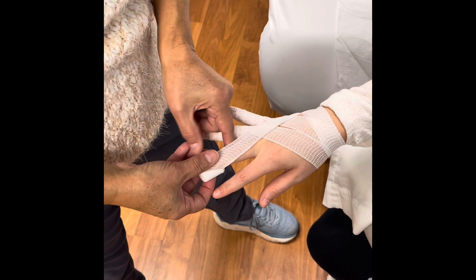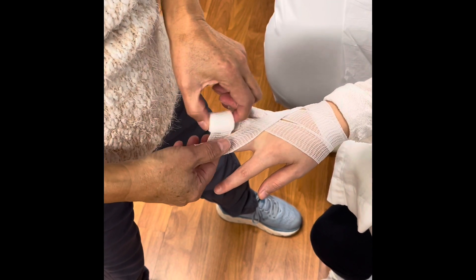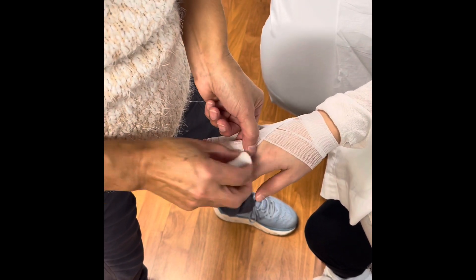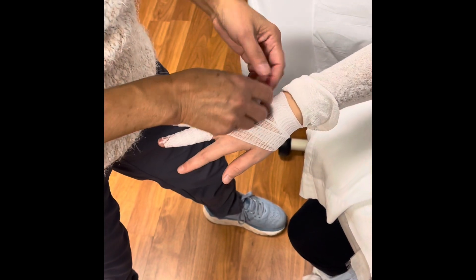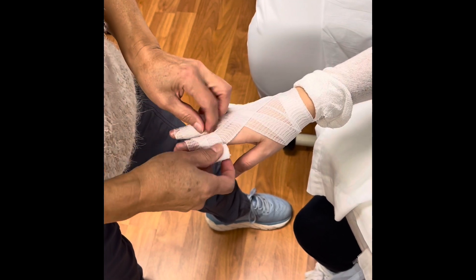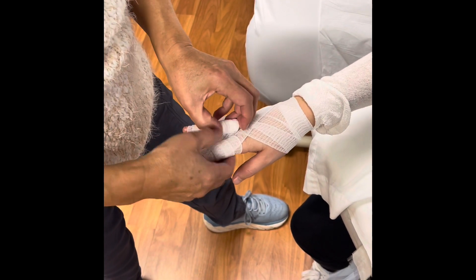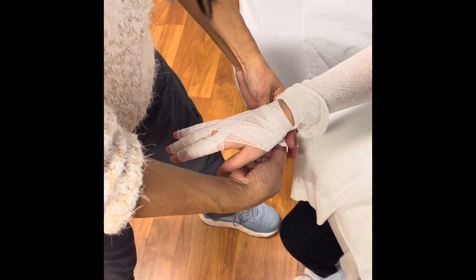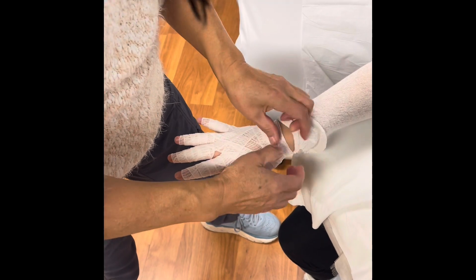Again, bring it down towards the tip of where the nail starts and go around, bringing it around the bottom and back to the top. Some therapists will use a two inch and fold it in half — that works as well. You may need more than one roll. I anchor this last piece at the wrist and move on to the next one.